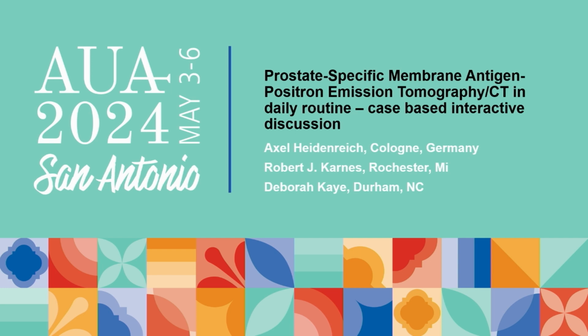It's kind of an expert opinion. So when you get a PSMA PET scan, and you might see a single lymph node, and the patient is adamant they don't want SBRT, they get a mentality, I want it out. Surgically, would you just go after the node? Would you talk about a more extended lymph node dissection? How many nodes would it take before you did the full extended lymph node dissection? Is this recurrent disease?